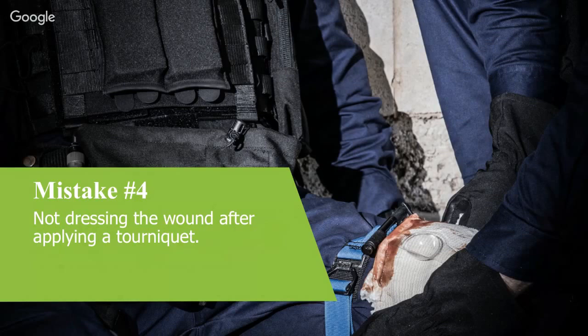An arterial tourniquet, when you think about what it does, compresses the artery against the bone. It's going to do nothing to stop marrow bleeding. So that's another reason why you want to put a nice firm pressure dressing onto a stump for a traumatic amputation. And the other reasons we spoke of, but once again, coming back to Stuart's point in the comments there, it is in the C of MARCH that you would do that.